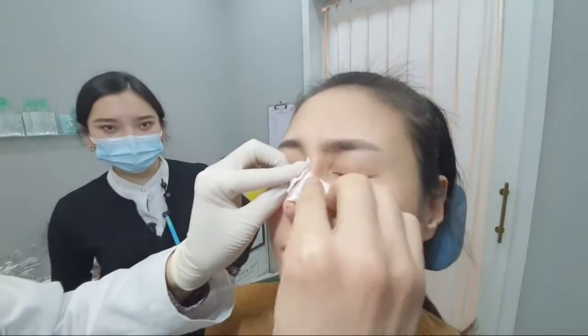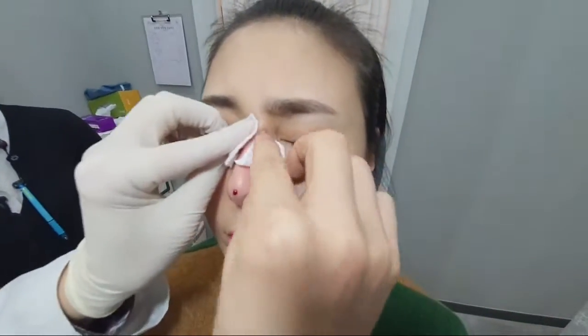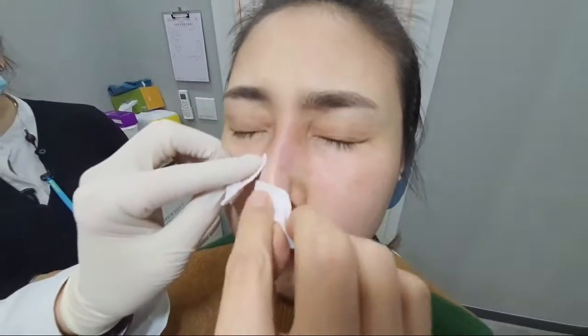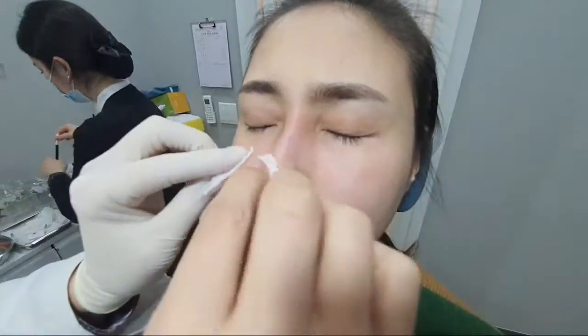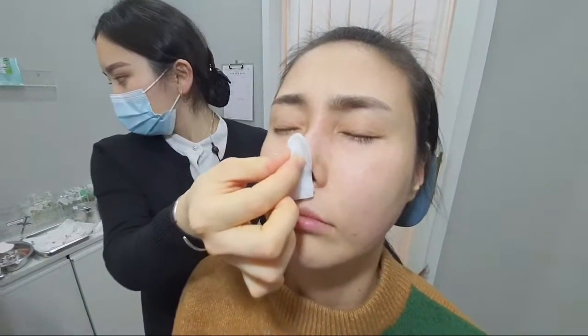And after the injection, putting pressure to form that shape of the bridge of the nose. Even the nose, the best point of injection would be either the second layer or the fourth layer.